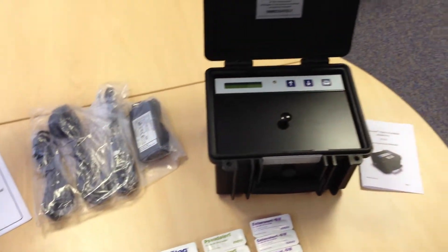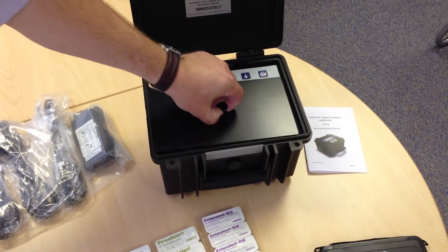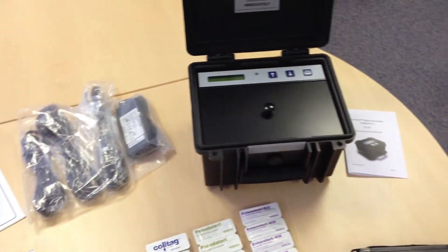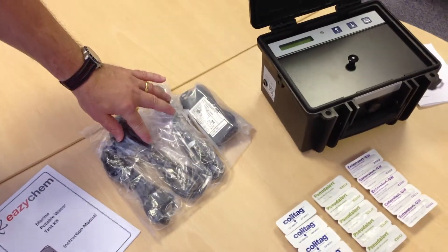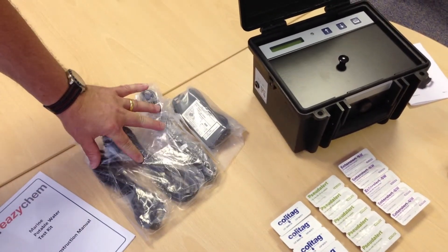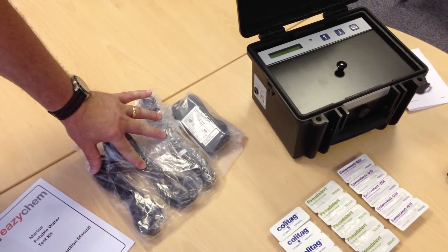Included within the kit is the digital incubator, which comes supplied with an AC adapter and the necessary plugs for whether it's Euro, UK, or US.